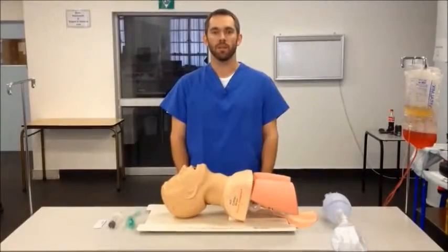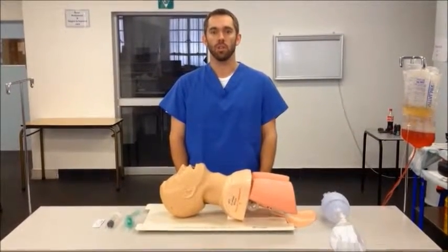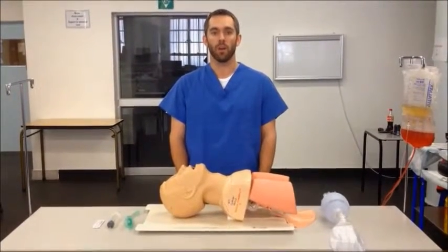Hi, this is Almira Westhazen with Cape Town Emergency Medicine, today talking about correct insertion and use of a laryngeal mask airway, or LMA.